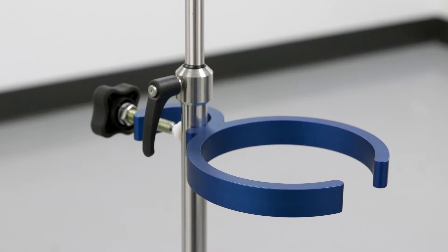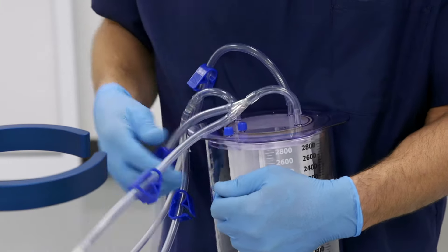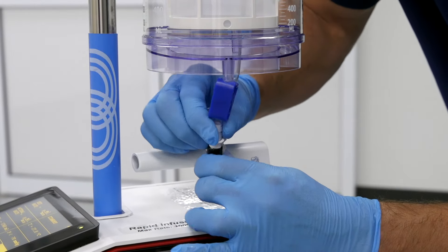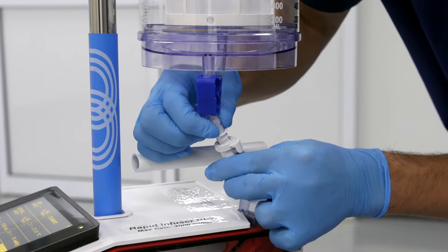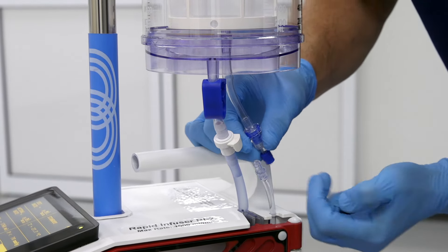Disconnect the fluid line by pressing the quick release tab while separating the fluid tubing. To install the large volume reservoir, attach the large reservoir holder, unpack the reservoir, connect the fluid spikes, and place it in the holder. Attach the large volume reservoir by connecting the fluid line to the quick release connector. Connect and tighten the recirculate line with the lure fitting.